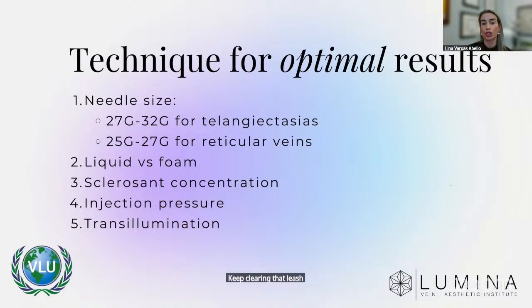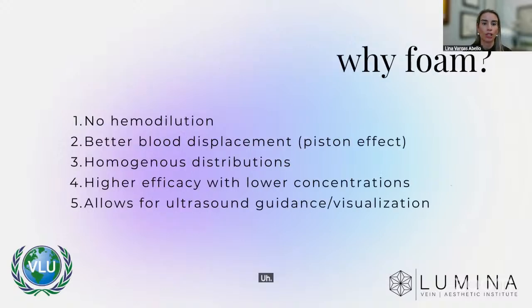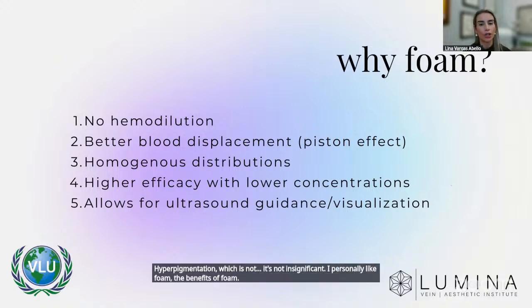I would urge you to just come out and go somewhere else, because that is going to lead to vein wall damage, and you can actually have extravasation, and that leads to one of the complications, which is hyperpigmentation, which is not insignificant. I personally like foam, the benefits of foam, especially for the larger telangiectasias, larger reticular veins, because anytime you're going to inject liquid, it's just going to get diluted with blood, and you are not going to get that 360-degree contact that we want.